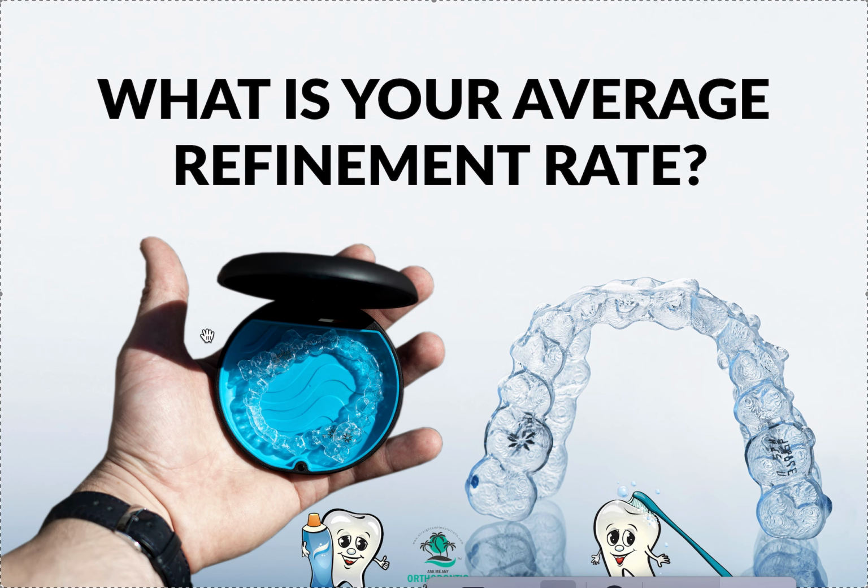But if they're busy, or if they're on vacation, or if they're a really busy person that's kind of groaning at the idea of coming in monthly for an aligner check, then I recommend putting them on a virtual check. For virtual check, you can use Invisalign Virtual, or you can use a handful of different other programs. Some are affordable, some aren't. The one I like is called In-Hand Dental. Very affordable, in the hundreds per month for, I think, up to 30 or 40 patients.